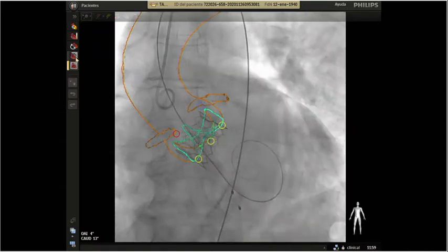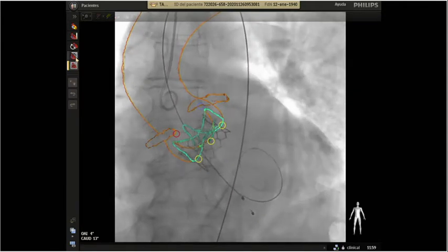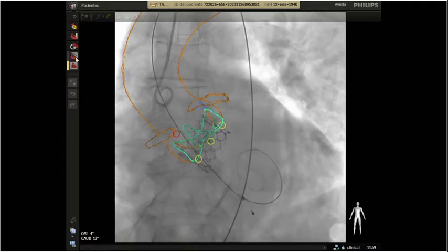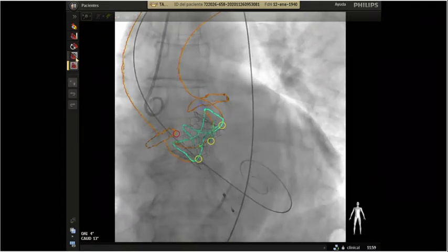Yes, probably. Well, actually, you had to rush during valve delivery because of the hypotension. So I understand that you had the feeling that the valve was a little too low, a little too much in the left ventricle in comparison to the medium marker, but well, that's perfectly all right. I mean, the results will be optimal.